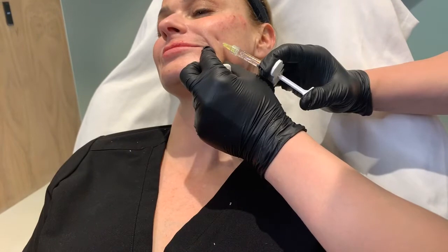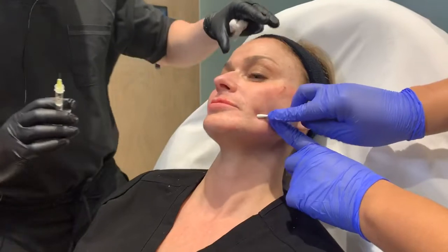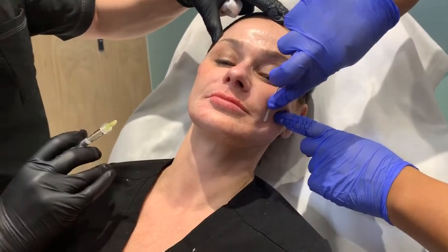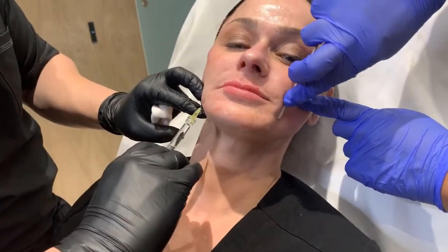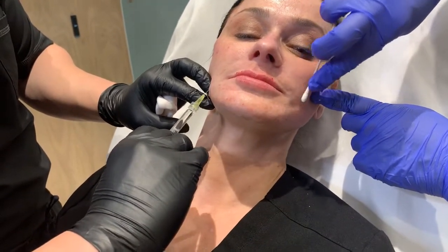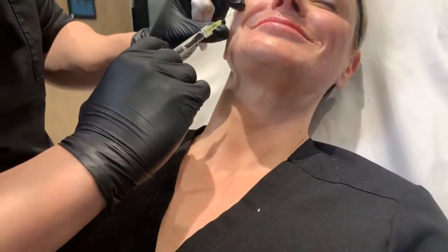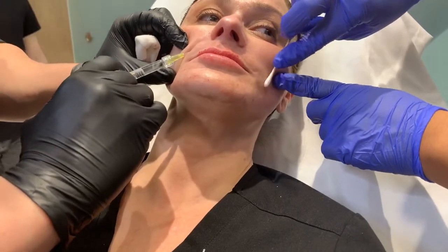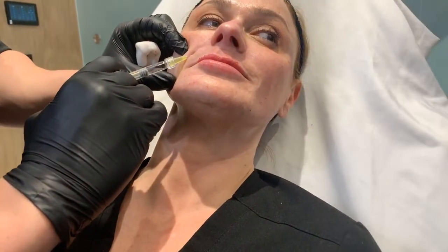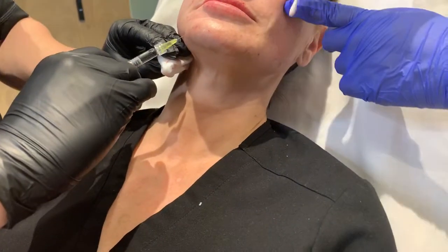This is our finishing touch. Just smile again. Good. This is our filler that fine tunes things. So we do Q-tipping on that. That's our Q-tip technique. Smile again. Great. So you see this fold, relax. Go right in the superficial part, get little blebs. This will hydrate and plump. Smile again. Good. Relax. Do a little into the fold. And this is bilateral, correct? This is bilateral. Correct. We're going to use a little on the marionette.